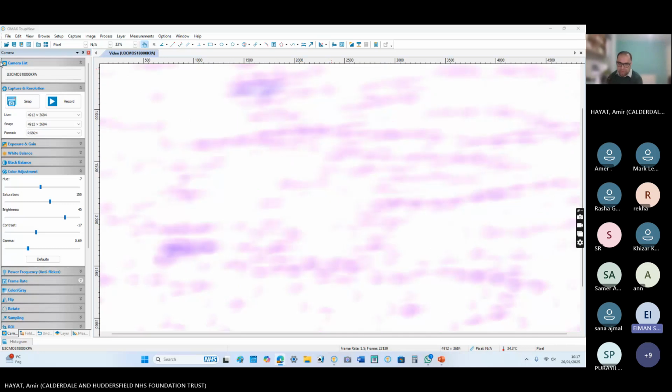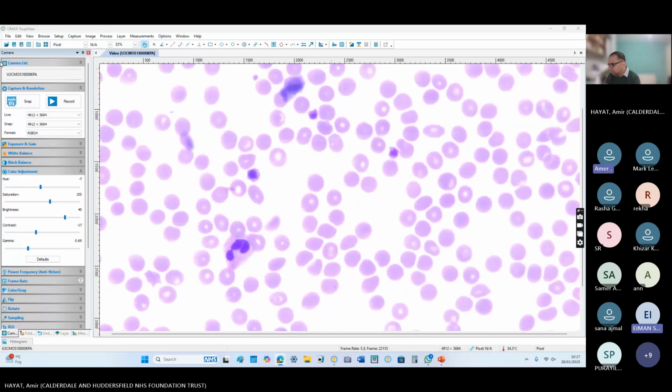Okay. So Rekha should complete the report, because you have to report this case for the exam. The findings are suggestive of macrothrombocytopenia. It can be inherited. The patient needs to be referred to the hematology clinic for urgent management and diagnosis, and genetic mutation testing is advised.